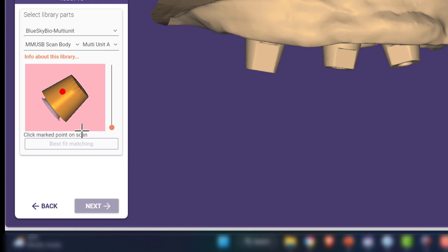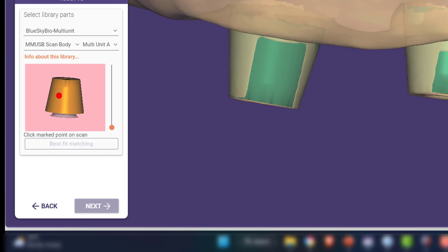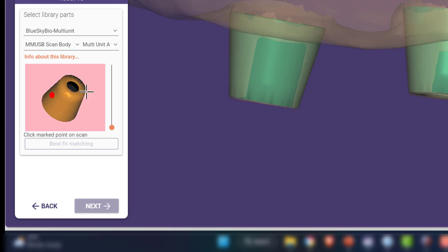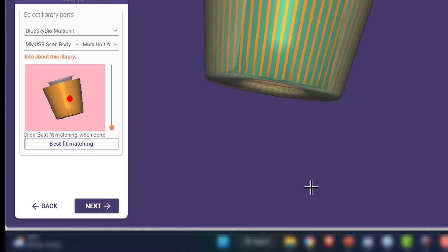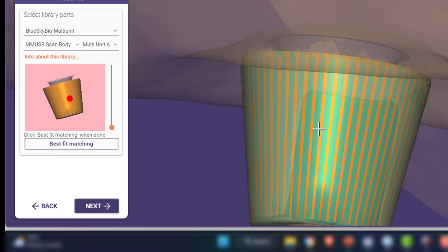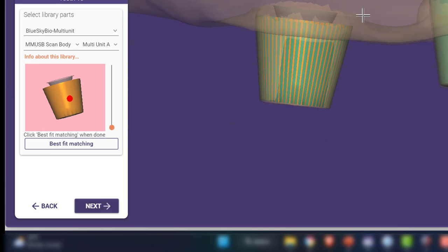Here is that scan body, okay? And that is the exact same mesh configuration as these green ones. No flats are present, none of that. And so it's just telling me to click right here in the middle of the scan body. I'll do that and then best fit match it. That is what you want to see. That is an absolute dead-on stitch.